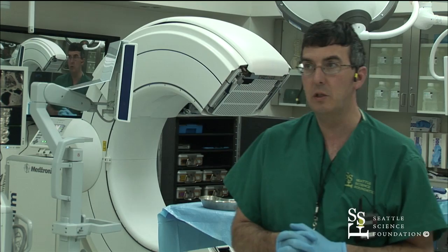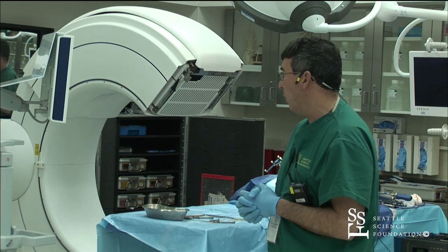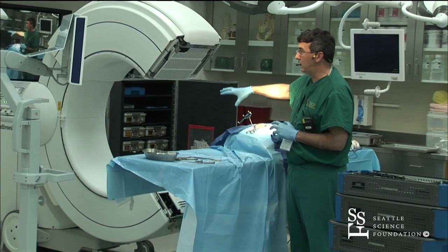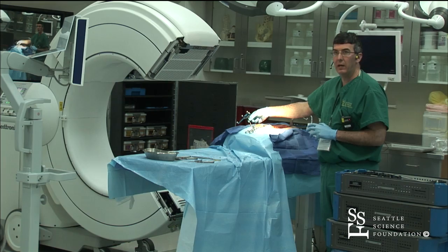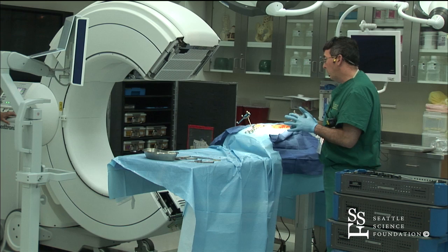So really quickly, just to go through a navigation system — they're all fairly similar. The best known one is obviously the O-arm. Essentially, this thing over here is our CAT scanner; it looks just like a CAT scanner you'd see in the CT room. What we're going to do — and if you're a neurosurgeon, you see with the heads it's a very similar system — you have a navigation system here which serves as a satellite. You get a CAT scan and it fills out into a computer system that registers everything into space, and then it uses this information and remembers it.